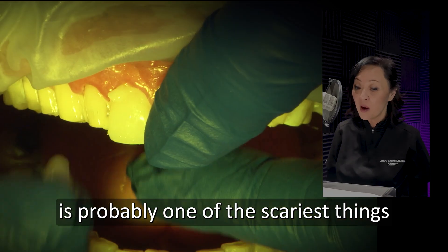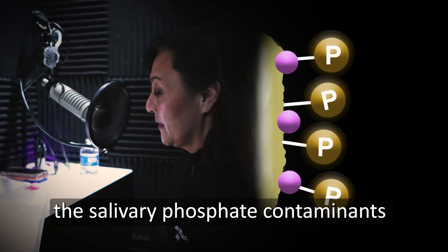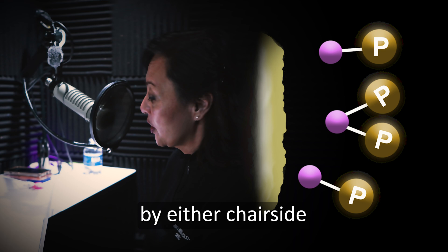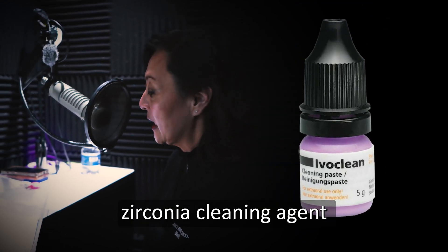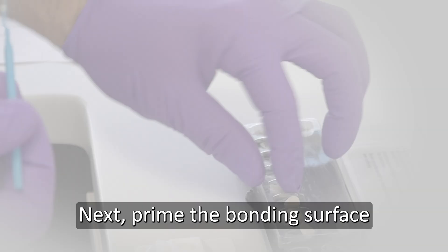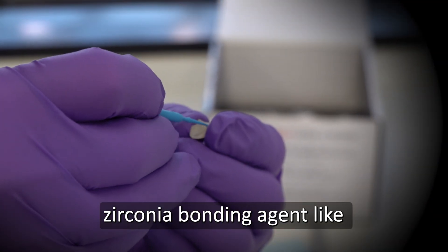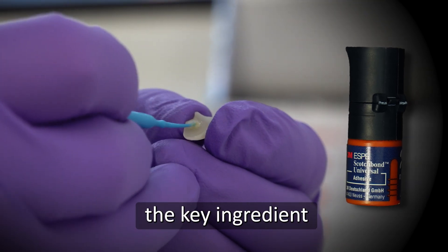Cementation of veneers is probably one of the scariest things we do as a cosmetic dentist. After intraoral try-in, the salivary phosphate contaminants must be removed by either chair-side air particle abrasion or a dedicated zirconia cleaning agent like Ivaclean. Next, prime the bonding surface with your favorite zirconia bonding agent like 3M Scotchbond Universal Adhesive. This contains the key ingredient.